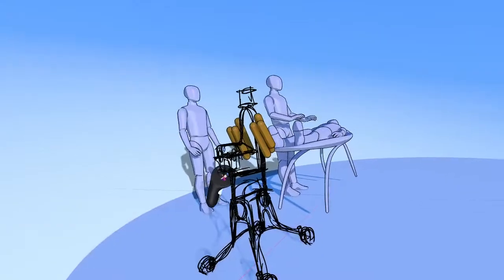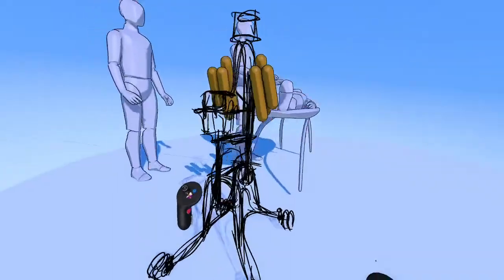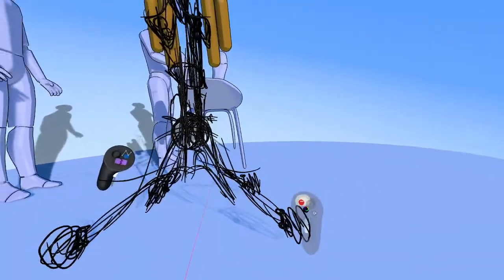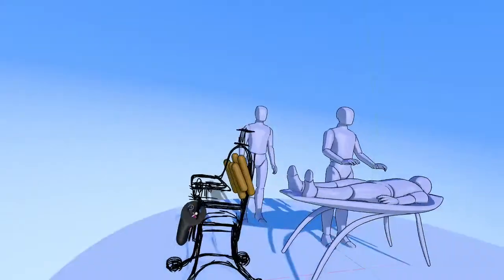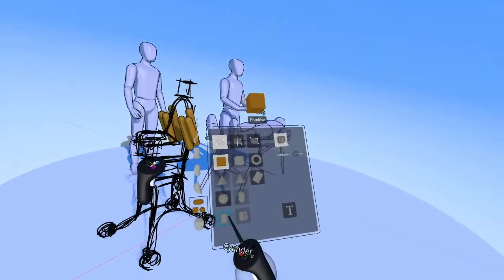As far as the base getting longer or wider, we can make it so that here it can split out like that and rotate. So we'll work that into the design in a little bit. Right now, I want to figure out the hinges for this guy.